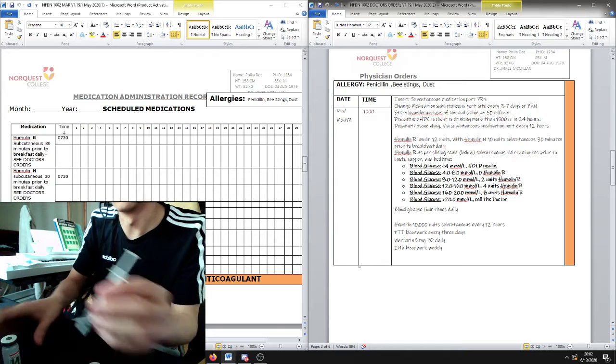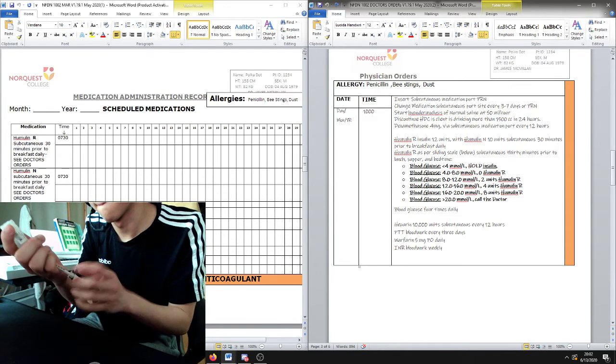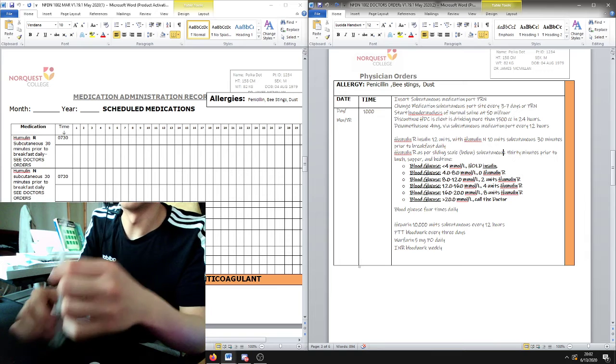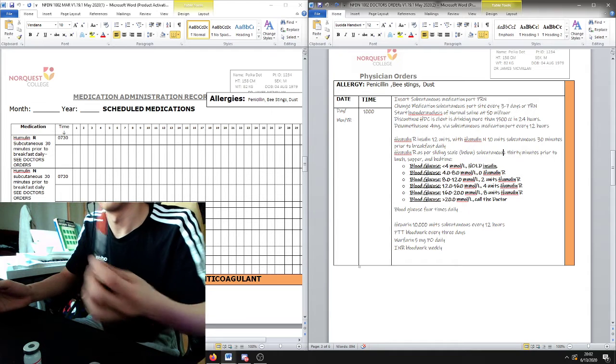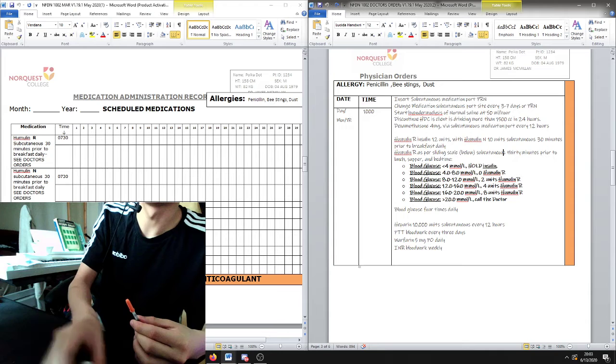Next, I'm going to draw my cloudy one, 10 units. Total of 22 units. And my coworker would witness this and will double check my calculations and will co-sign the documentation later.